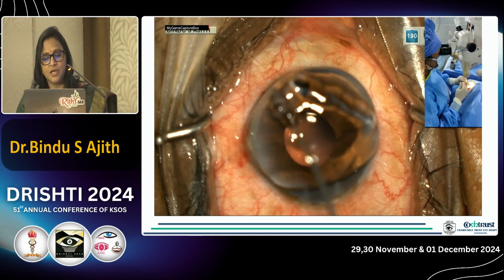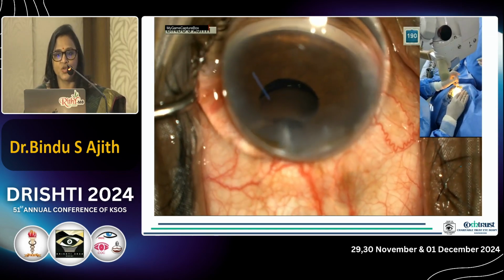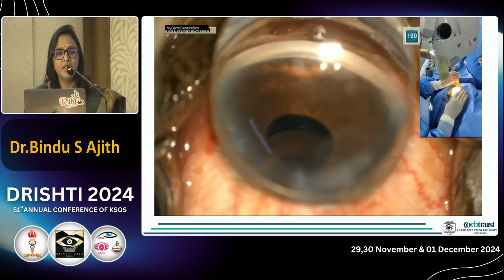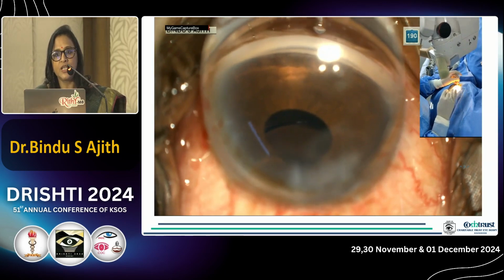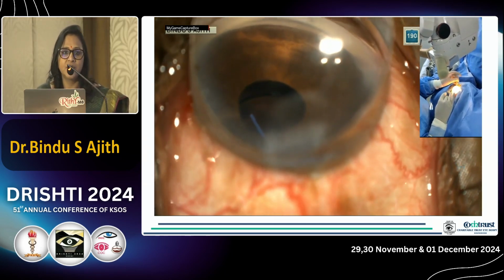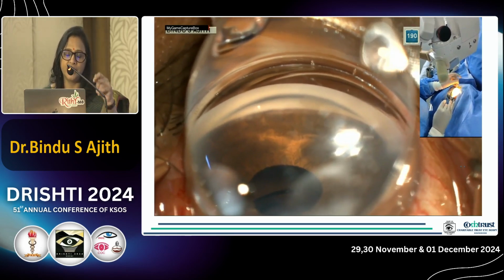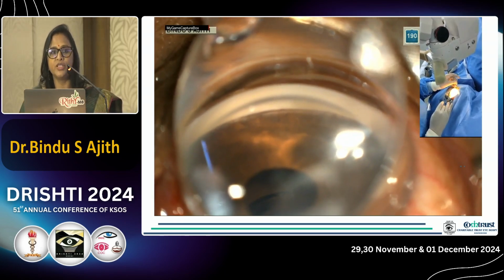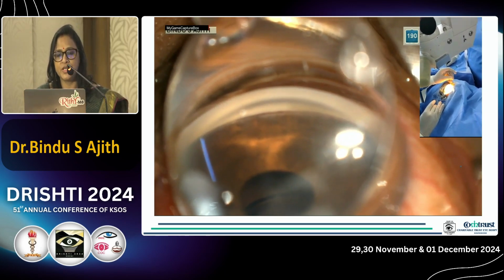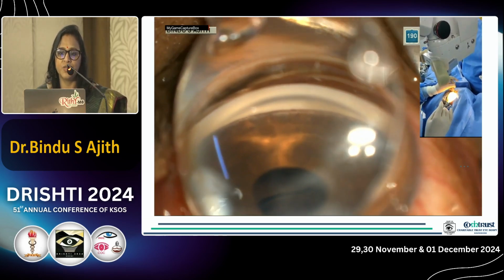The best advice is, after all your phaco surgeries, start doing gonioscopy. Repeat it and keep on repeating till you are confidently seeing the angle. Then, with a long instrument like an iris forceps or iris repositor, just go and touch the angle. So you get used to having two hands, with the non-dominant hand holding the lens, and the dominant hand going in with your second instrument. Have a feel of it, be comfortable with that, and then go on to procedures like the bang and the KDB, which Satyan sir will be teaching us. Thank you so much.